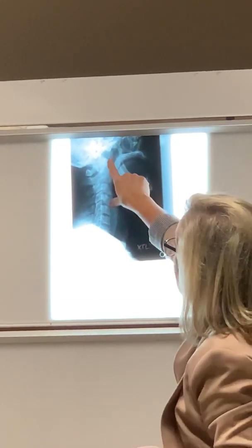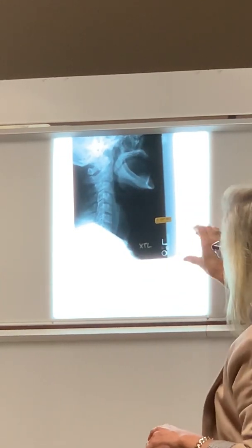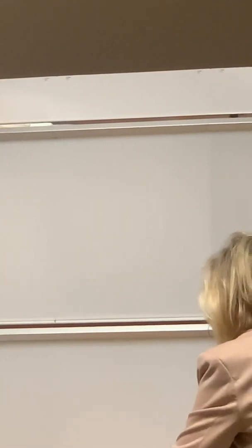This one has the mandible pretty much out of the way. We could have pulled it out just a little bit more. I think flexion extension is next, right?